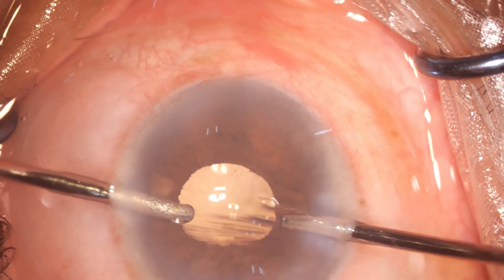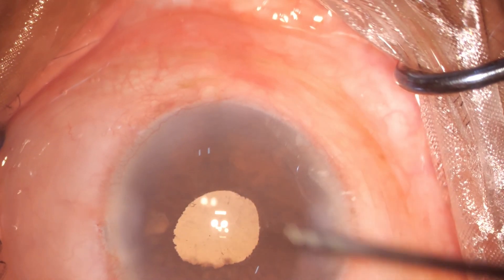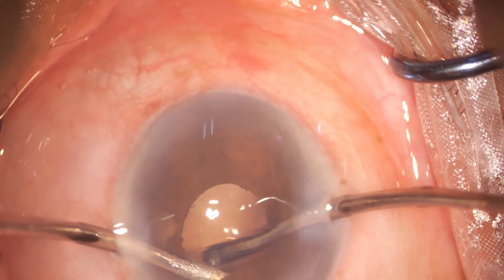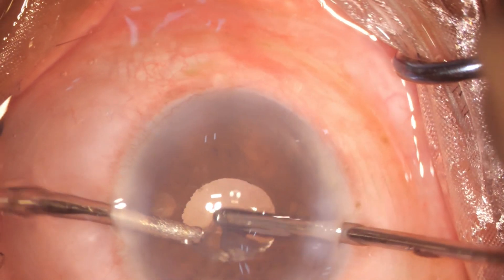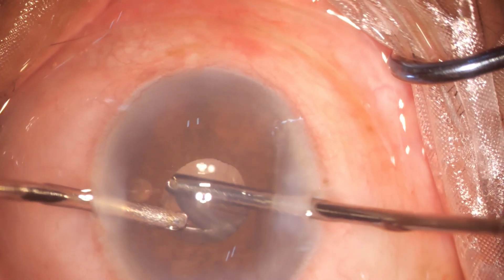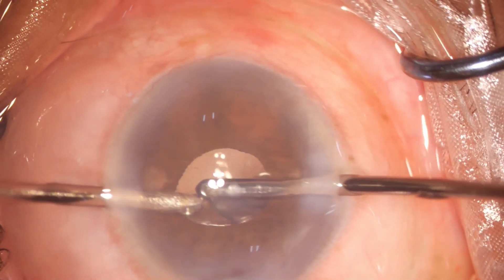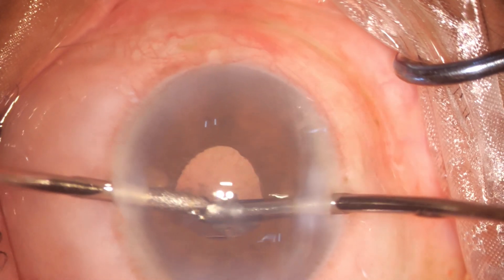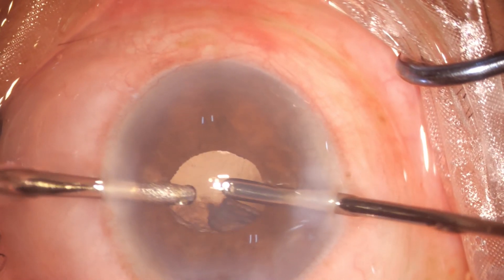Till now everything is okay. Should one leave the case at this stage or try further negotiation? Checking with the aspiration cannula, trying to get a little bit out. The lens itself is moving with the bag, so probably the anterior capsule is in the aspiration port — one releases it.